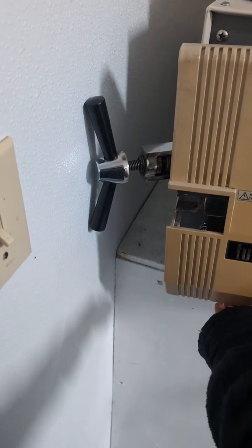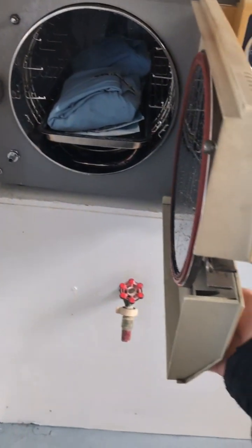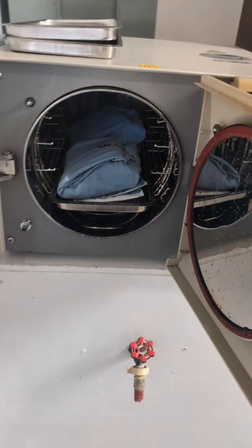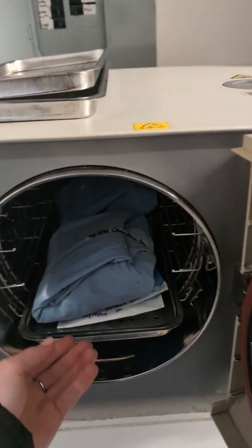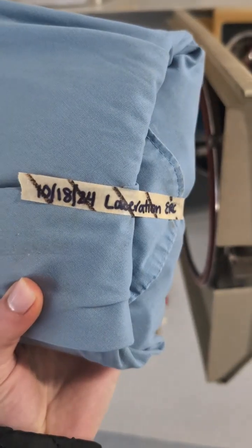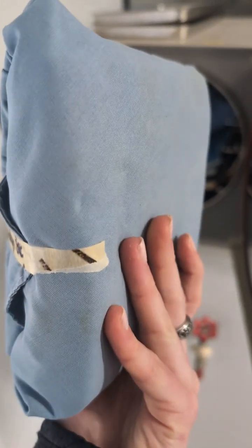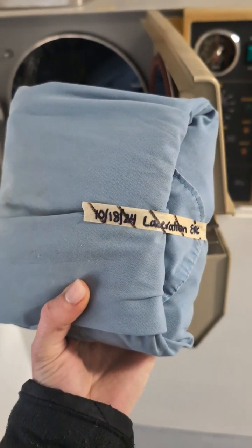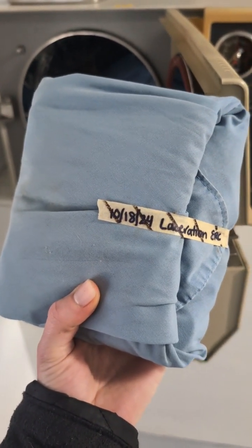It is warm, so you just want to be careful. And then we'll just let this air out and cool off. Okay, now that everything's cooled, we can double check. So this tape was not striped before. Now that it's striped, that shows that it is now sterile. And then we'll also double check the tape or the tab on the inside to make sure that everything is sterile.